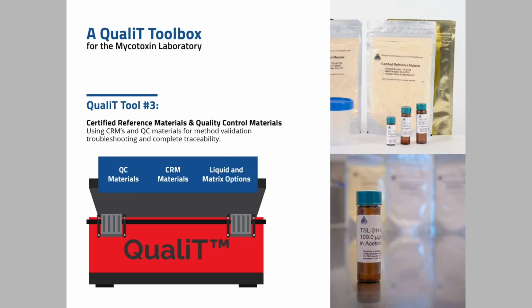A third tool in the QualiT toolbox are certified reference materials. These, along with quality control materials, have a place in the laboratory when doing method validations, troubleshooting, and anytime you need complete traceability.